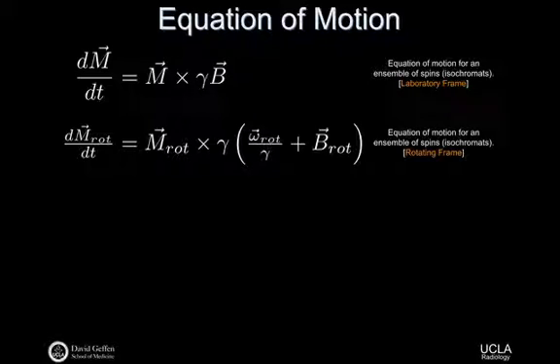The other thing, and this is the less obvious thing, we have to add in is this omega rot divided by gamma. And this is effectively what demodulates, right? Omega rot divided by gamma is related very closely to the externally applied B0 field, right? Because we know from the Larmor relationship that omega equals gamma B0.